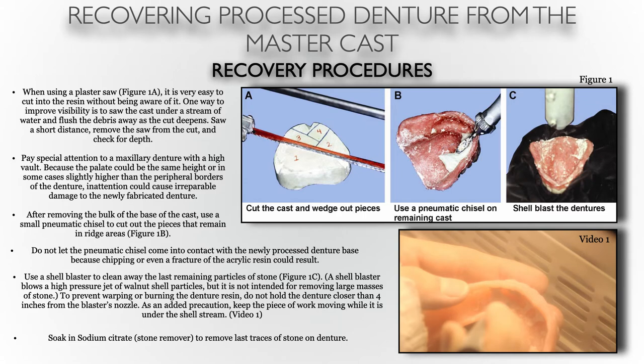When using the plaster saw, it's very easy to cut into the base without being aware of it since the model is upside down. One way to improve visibility is to saw the cast under a stream of water and flush the debris away as you cut. It can also be very easy to cut the palatal section of a maxillary denture — if the patient has a deep palatal vault, you can be cutting into the denture base while so far from the borders. So be very careful when performing these cuts.